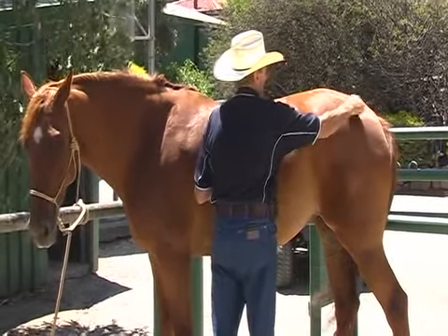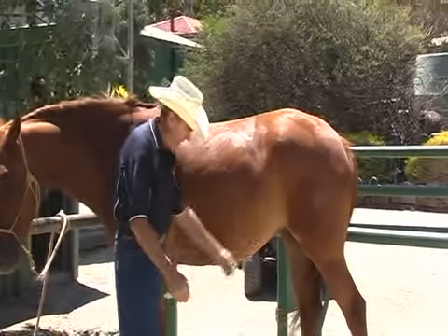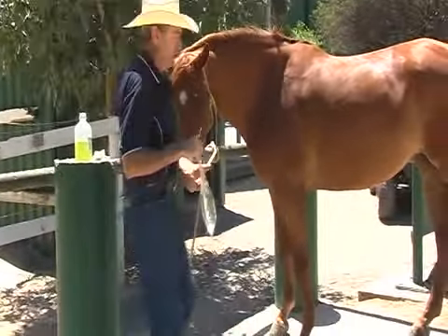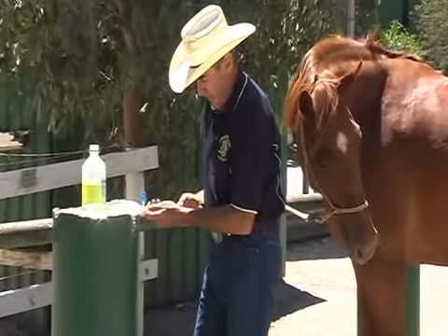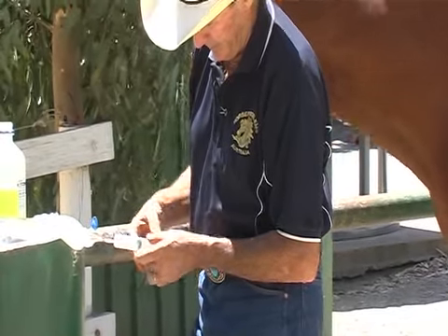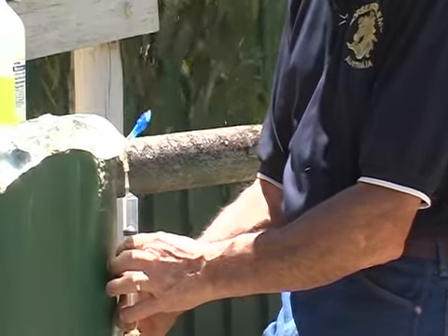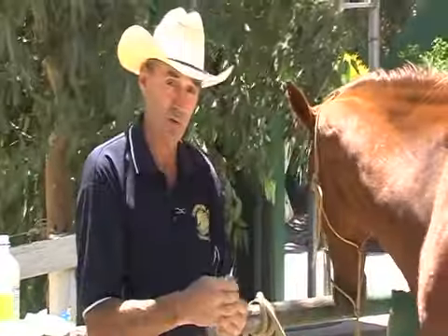I've got something else, and the secret here is to not mess around, to stay way forward in case a horse kicks you, to get your penicillin into your syringe, depending on the dose rate, normally 15 or 20 mil. I'm going to use saline here, and if we're putting 15 mil in, always draw back and take as much as you like, 20, 25 mil, and then let it run back up into the bottle to get rid of the air bubbles a fair bit, and then you've only got a little bit to get rid of. Give it a few flicks and get rid of the air bubbles that may be there.